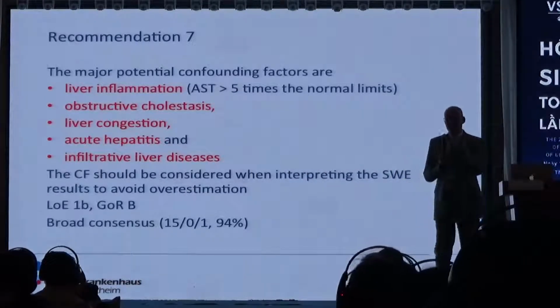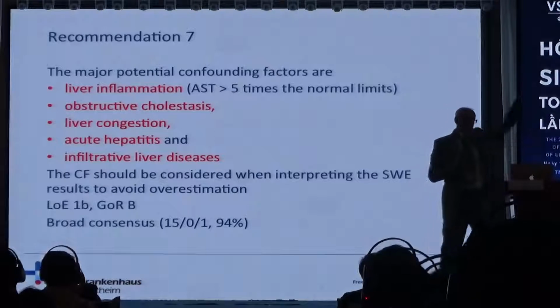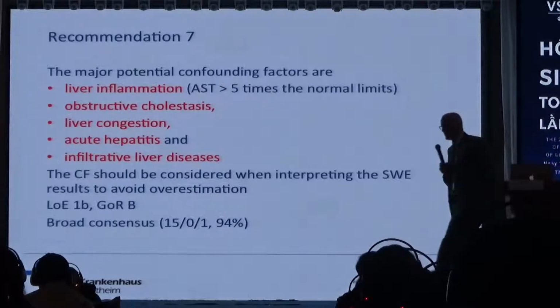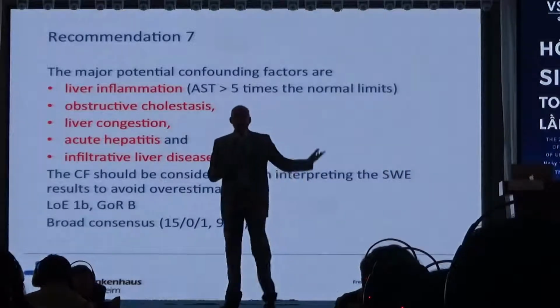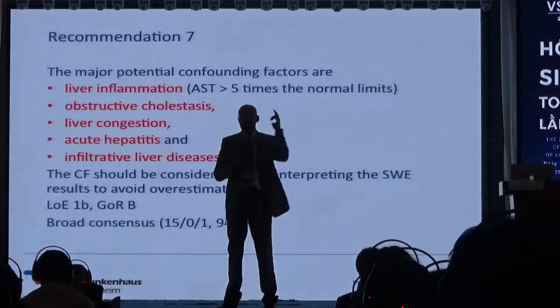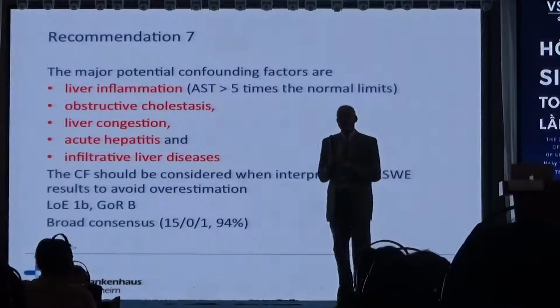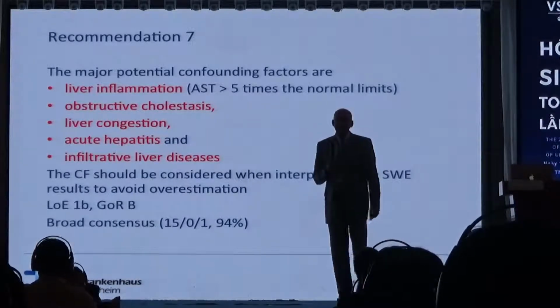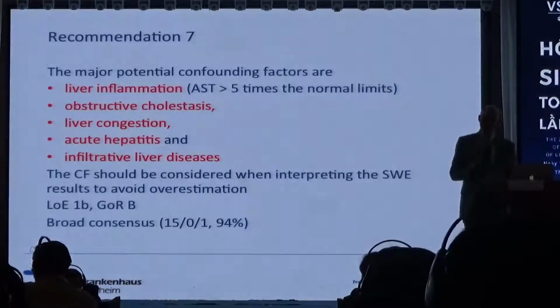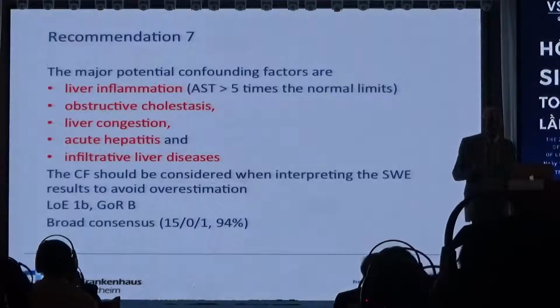If you use elastography for a patient with hepatitis C, the question is whether there's normal liver parenchyma, so shorter treatment, other drugs, no ribavirin, or whether there is liver cirrhosis. Then you have to change your treatment, give it longer, it will be much more expensive, and in some circumstances, with genotype 3 for example, you also have to give ribavirin. So if I'm doing elastography in a patient with chronic viral hepatitis C before treatment, it has a clear benefit for the patient to know the result. That is what I want.